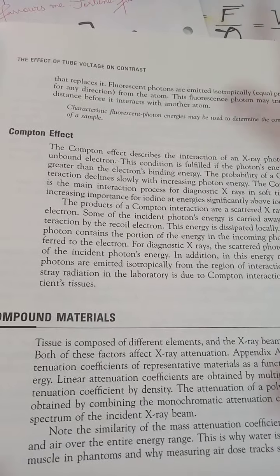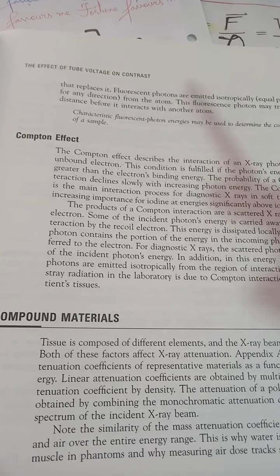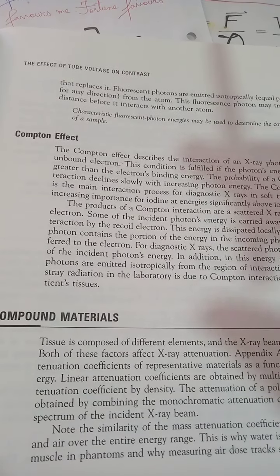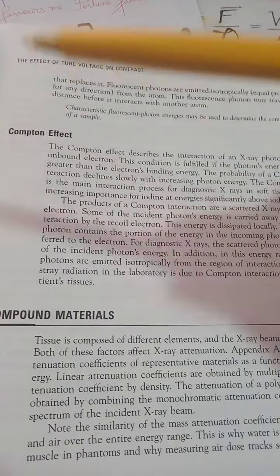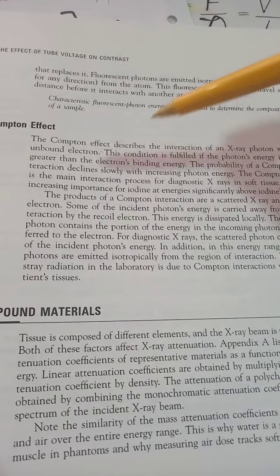The Compton effect is a main interaction process for diagnostic X-rays in soft tissue. It's of increasing importance for iodine when energy is significantly above iodine's K edge. The products of a Compton interaction are a scattered X-ray and a recoil electron. So that's why you have to have an understanding of the angular incidence, angular momenta in this case.